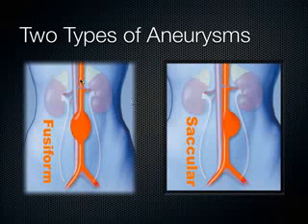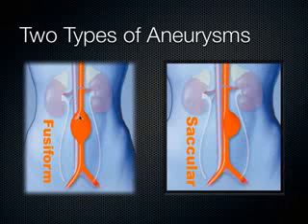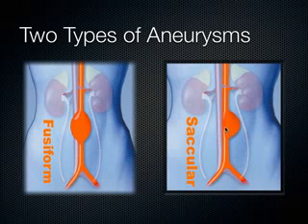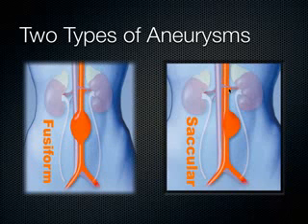Excellent. Yeah, transverse, because let's say we're doing sagittal first. Over here, sagittal, it would pick up the fusiform, right? Because it's concentrically dilated. But if we do sagittal right here, it might look normal because we might miss this sac hanging off the aorta here. Whereas with transverse, we're like, okay, normal, normal, normal. Whoa, aorta aneurysm, normal, normal, normal. Over here, we're like normal, normal, normal. Uh-oh. So that's how transverse would pick them both up.